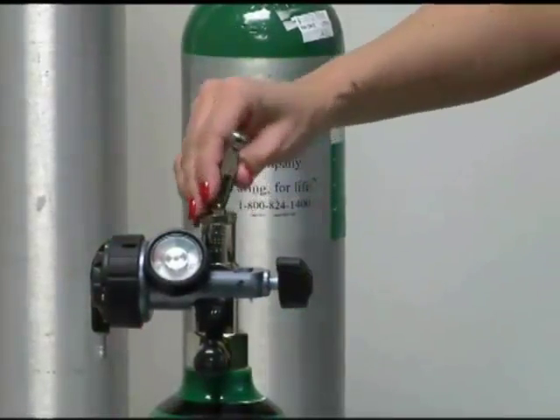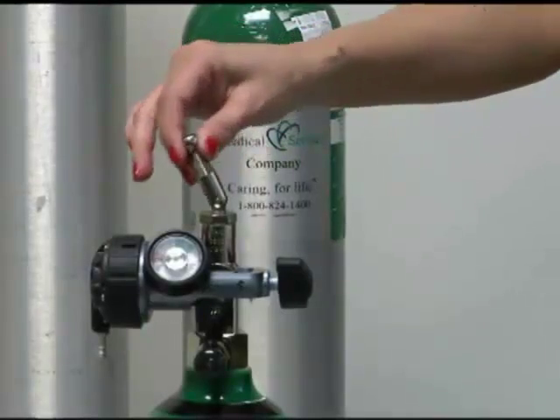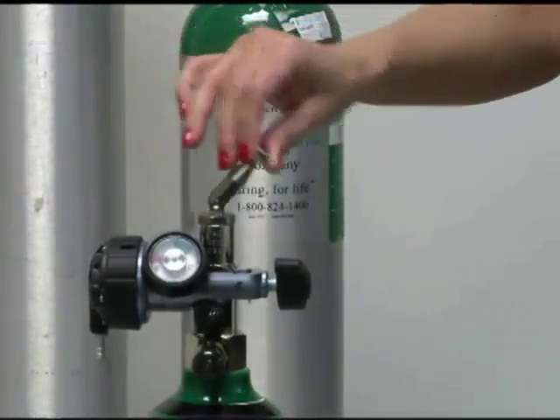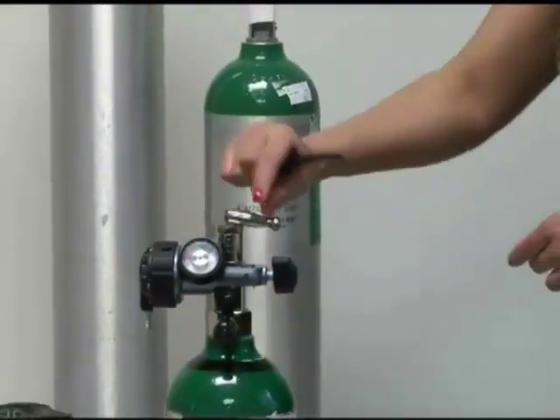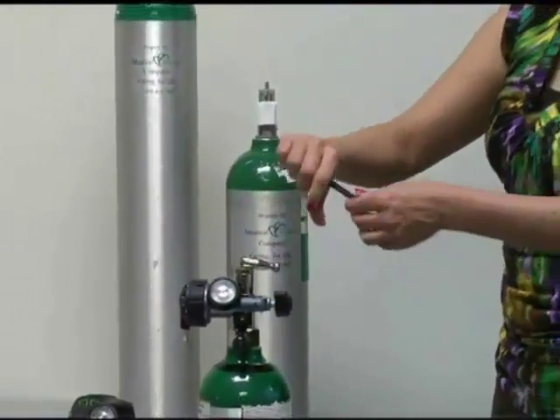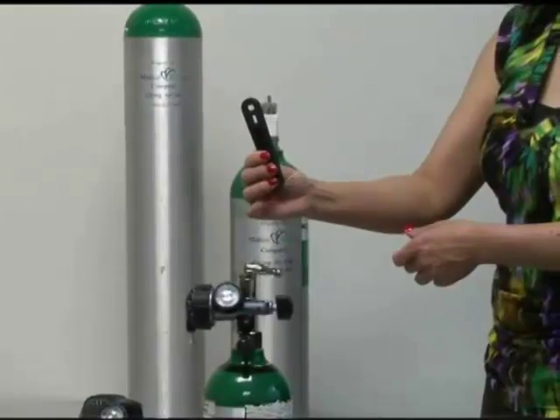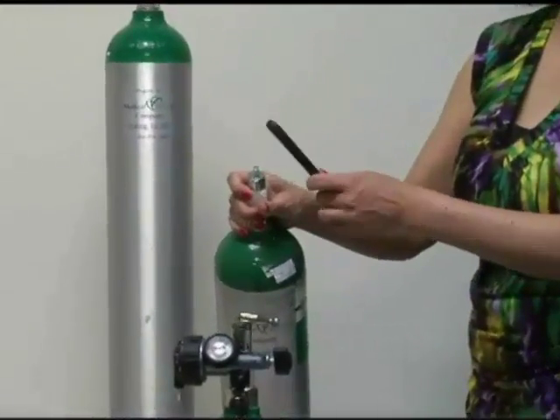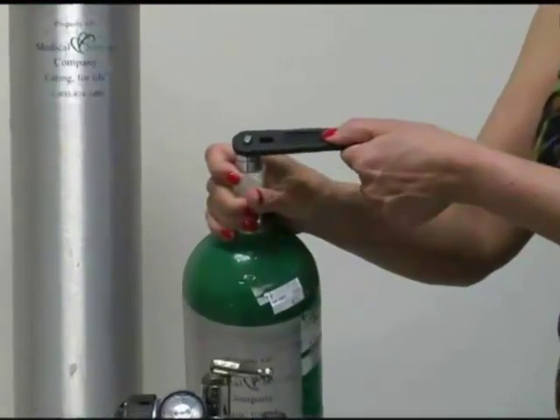Once it's tight and snug, the gauge is on your tank. You'll notice on the top here you've got a little toggle switch — you can use this to turn your tank on. Some tanks do not have this toggle and you'd have to use an O2 key. You can see on this tank here it does not have a toggle, so you would put this key on top.